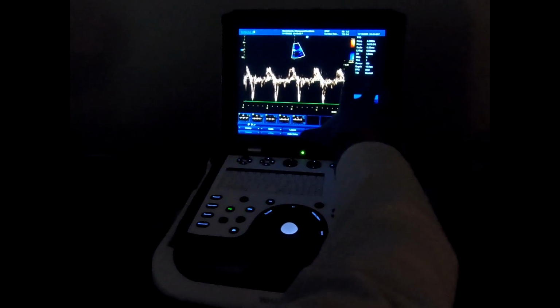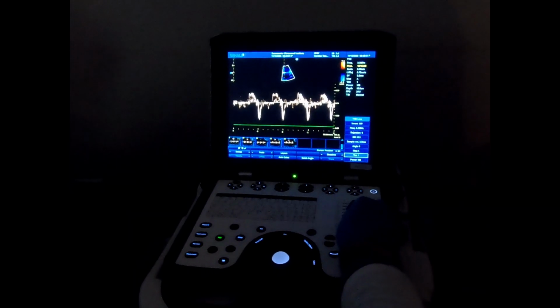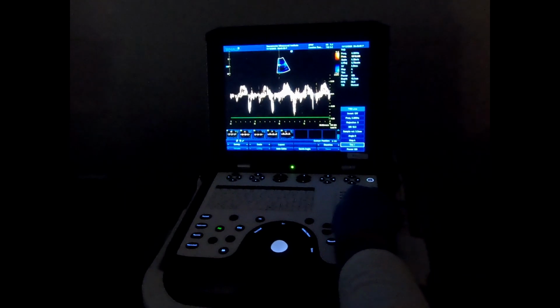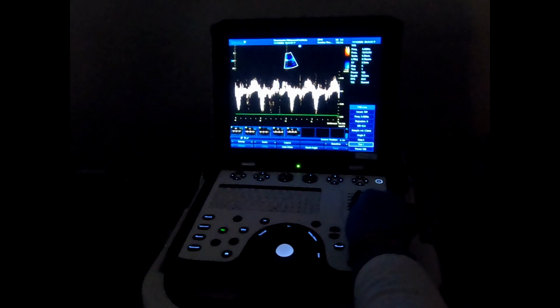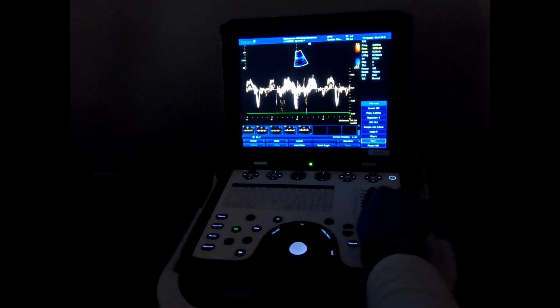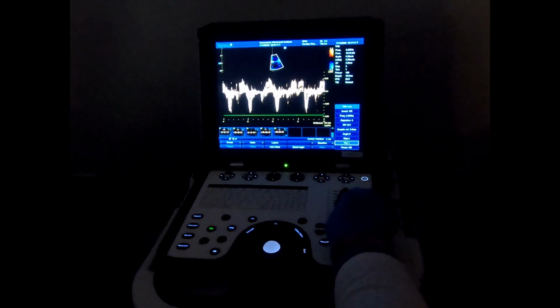I can really zoom in for you, but you can decrease the size like this. This is the S, the E, and the A, right? You can tell, yes? I don't like to show overgain like this. See? You can't really see. This is overgain, and it's not very clear. It's thick.